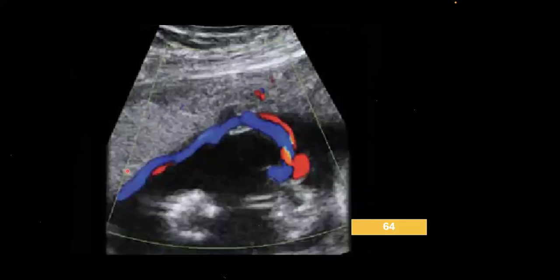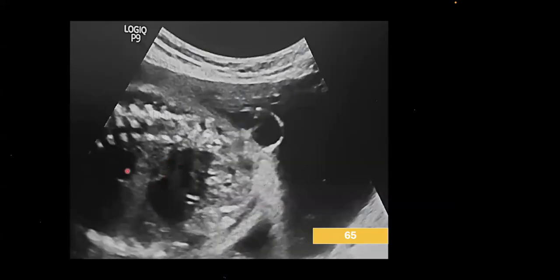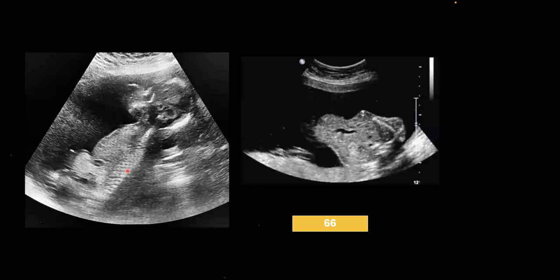Very good. No, maybe Samsung in this image it is appearing single, but I think there are triple vessels. 65. Very good. Tamil, Govindraj, iPad, SS, Samsung, all correct. This is the last quarter for the day.